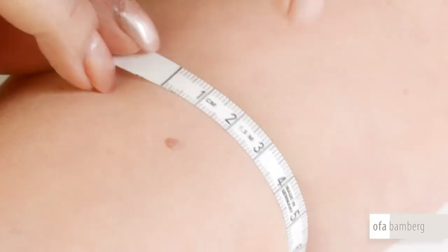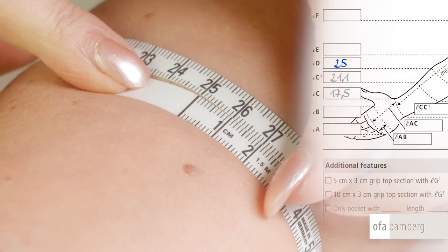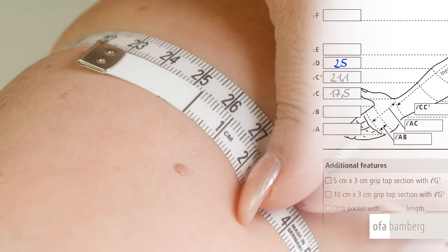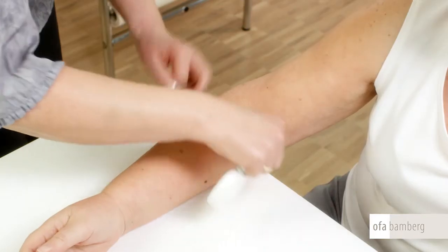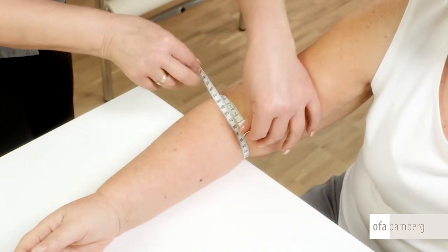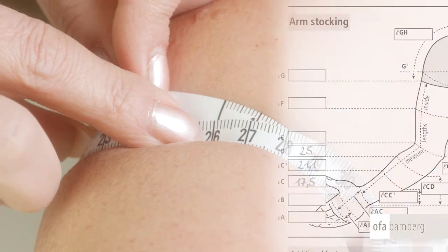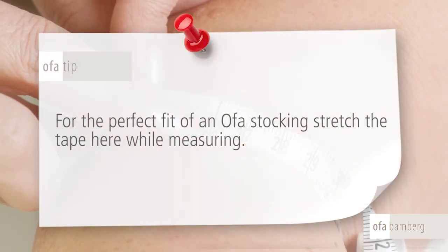Measure the circumference of point D at the widest area of the forearm, which will be roughly in the second third. Stretch the tape while measuring. With the elbow slightly bent and without stretching the tape, measure the circumference of point E, which is located on the elbow and the crease of the arm. OFA tip: for the perfect fit of an OFA stocking, stretch the tape here while measuring.